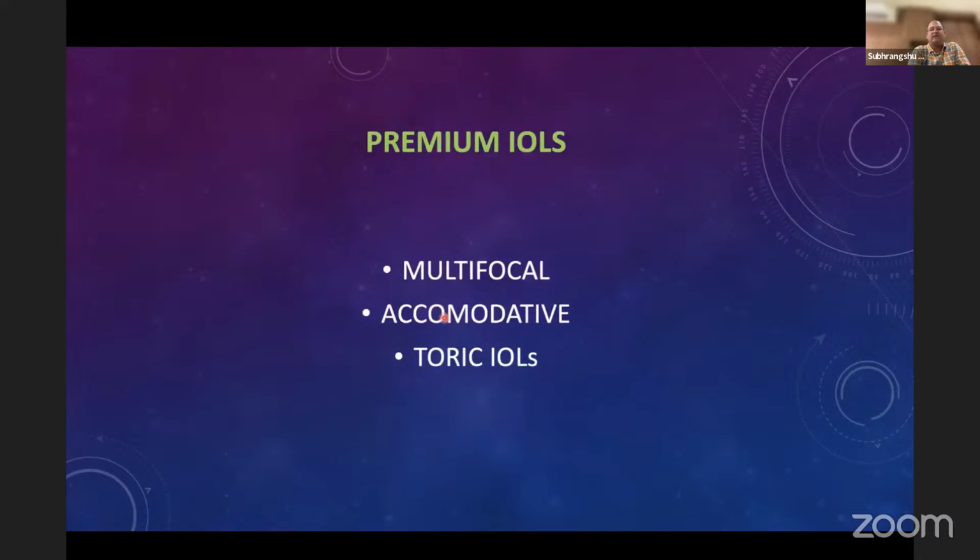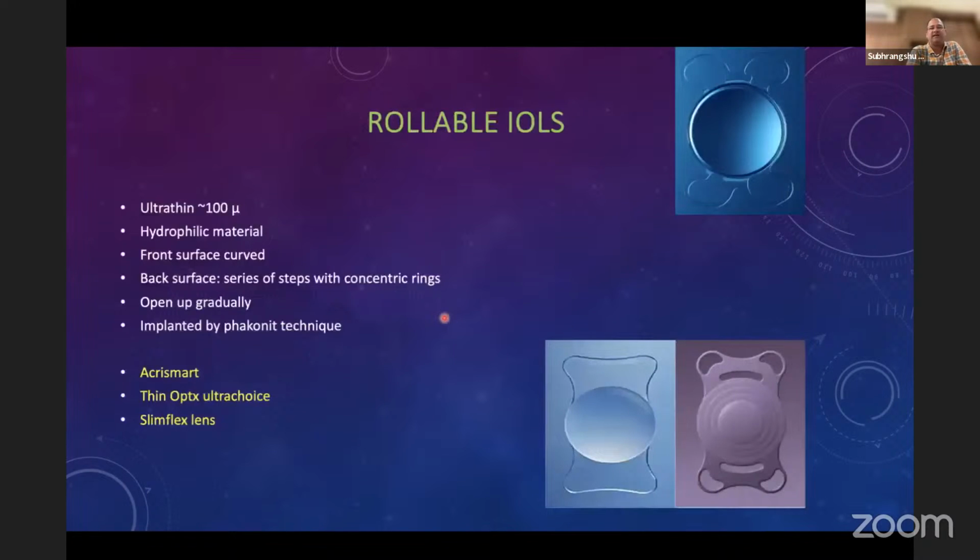Now, premium IOLs are multifocal, accommodative, and toric IOLs. I'll not be discussing them because they will be taken up, I think, in the very next class. Then there are the rollable IOLs, which are ultra thin, less than 100 micron thickness IOLs, which are essentially hydrophilic materials with a curved front surface and the back surface with a series of steps with concentric rings, and they are implanted by the once popular phakonet technique.